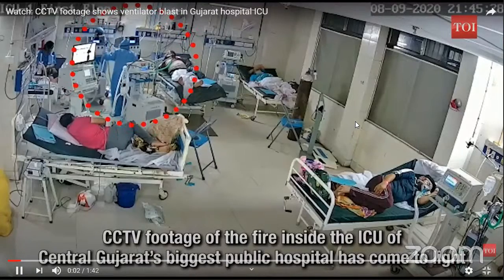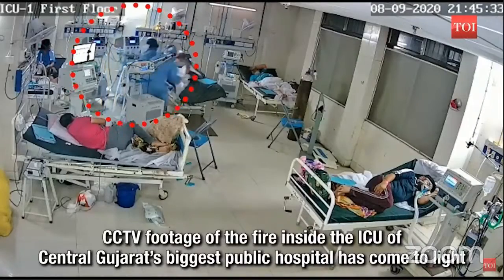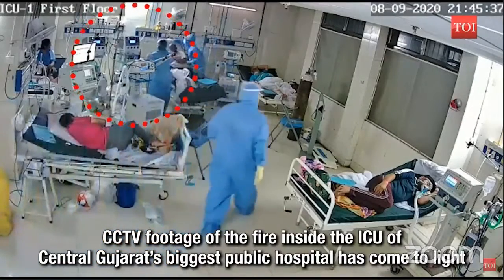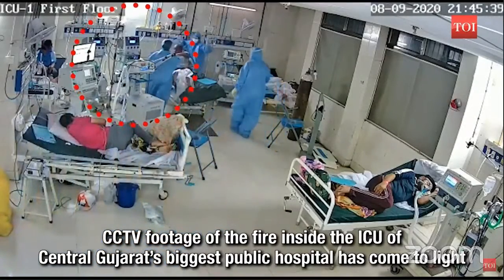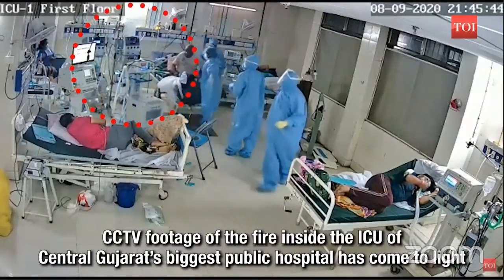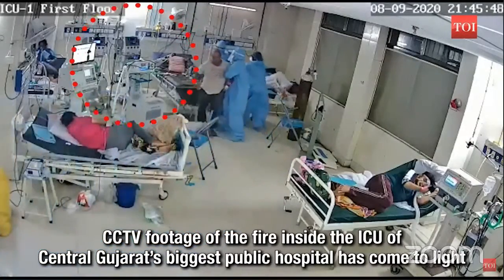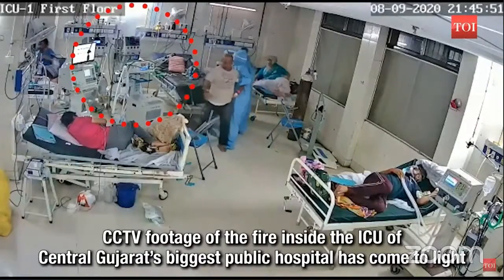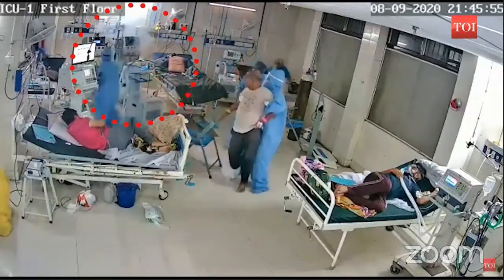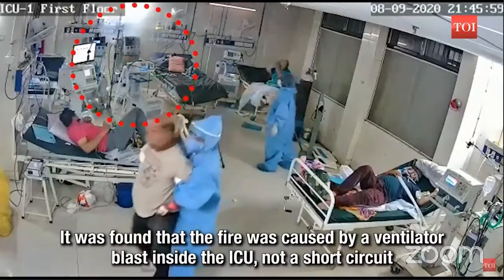A day after Central Gujarat's biggest public hospital witnessed a fire inside the intensive care unit of the COVID hospital, CCTV footage of the incident emerged on Wednesday, revealing that the fire was not from a short circuit, but because of a ventilator placed inside the ICU-1 unit located on the first floor of the SSG building. The footage, which was widely in circulation, clearly shows that there was a kind of blast inside the ventilator, after which the fire started, resulting in panic among the staff and patients present inside the ICU.